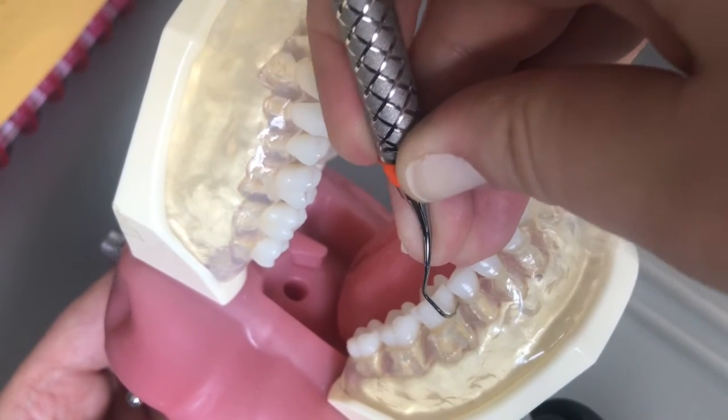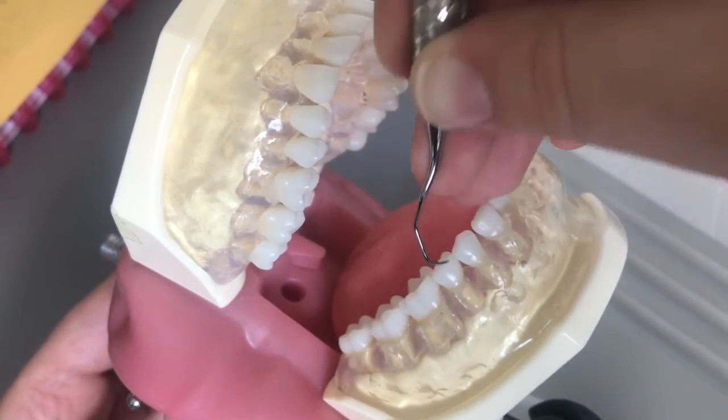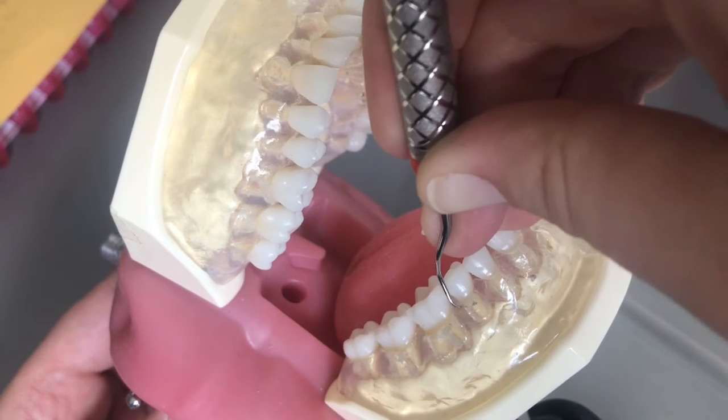You don't want to pull out of that sulcus. And at that 0 degrees, come up on the blade.